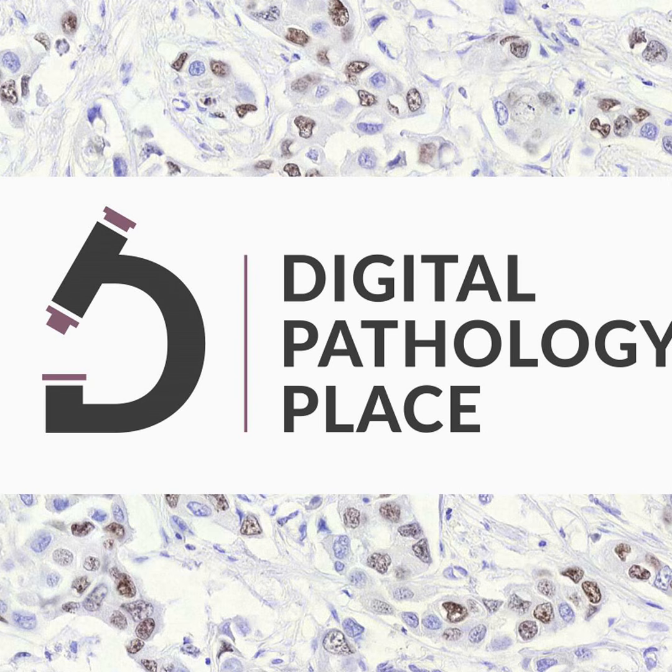There are no FDA pre-market requirements for this AI software for veterinary medicine. For veterinary drugs, veterinary medications, there's normal FDA approval, and this has to go through a specific drug development process. In human medicine, there's this framework of software as a medical device. It's a medical device, and then FDA regulates these medical devices when they become products. In veterinary medicine, nope. That means for the companies that are providing this, fantastic, that's their playground. For the veterinarian, very, very high liability of something that maybe is not that thoroughly tested yet, right?